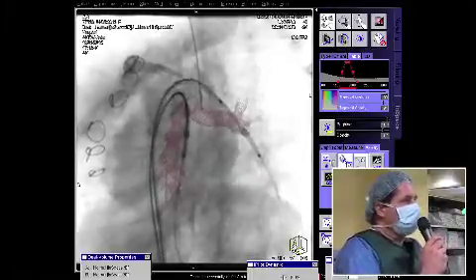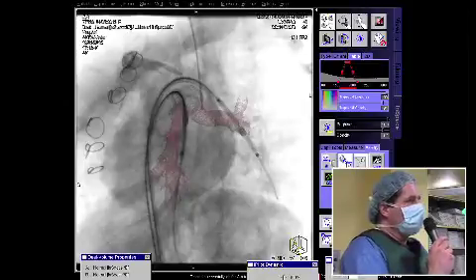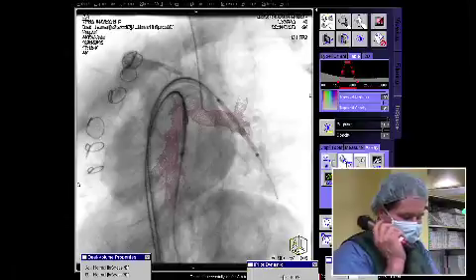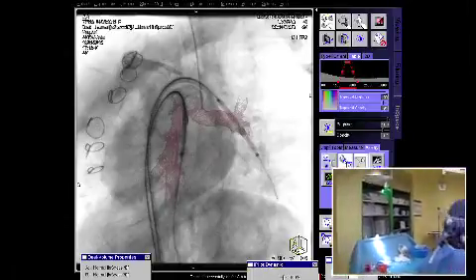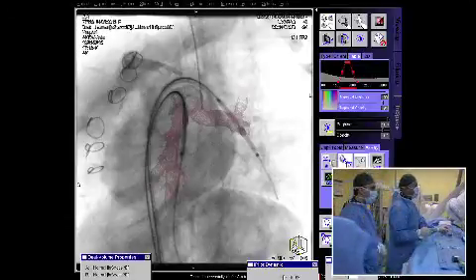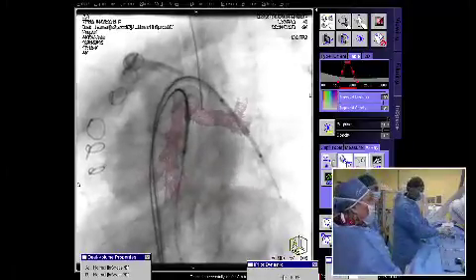But now, as you see in this small child, the PAs get twisted so much that it's not really fitting to the roadmap. Yeah, but anyway, you may see we have taken a caudal angulation with the left angulation, and anyway, the roadmap helps a bit.